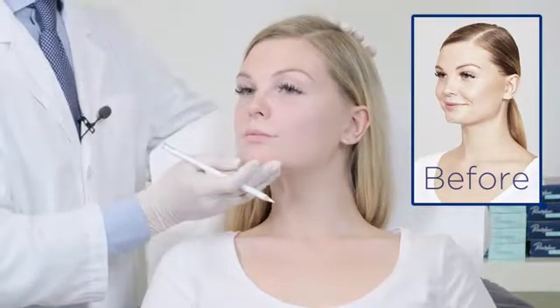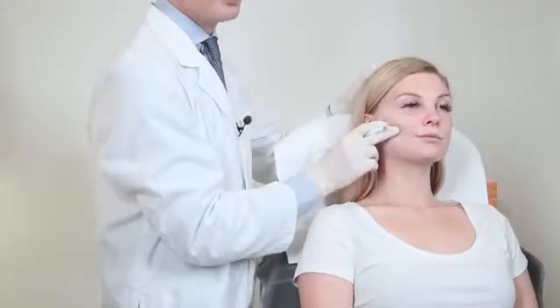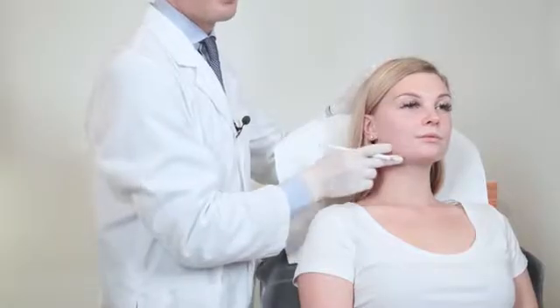If we look closer at the lips, we can see that the proportion from the upper lip to the lower lip needs enhancement. It's very important to preserve the shape of her lips to fulfill the request for a natural looking result. Now if we look at the cheeks, we can see a flattening of the cheek in a 3/4 view. By just adding a bit of volume in this area, we are cosmetically enhancing the proportion of the cheek to the lower third of the face.